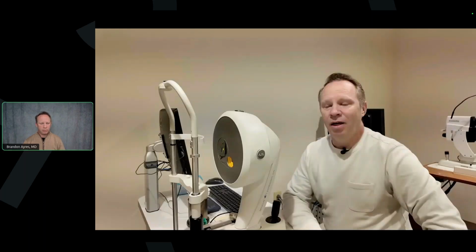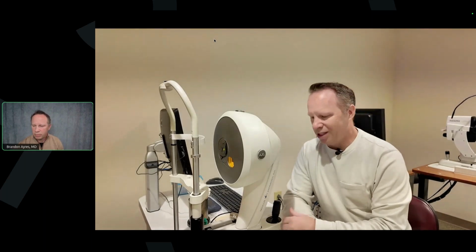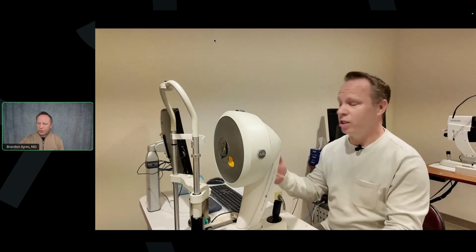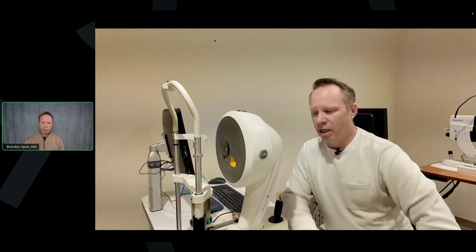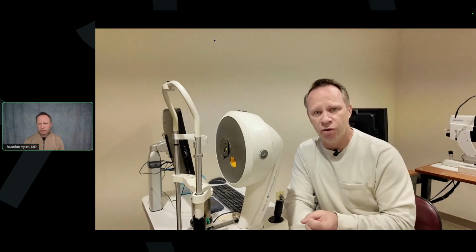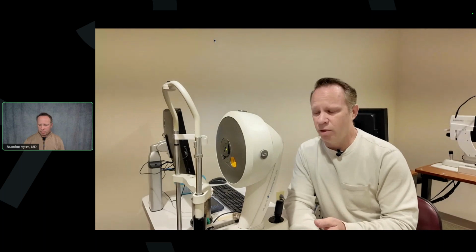Well, here we are in the office, and I figured no better way to discuss the importance of the Pentacam in following our keratoconus patients than to actually bring you in to our Pentacam. I mean, we use our Pentacam to initially screen patients. We use them to monitor, to screen for progression. We use it to see the effect that we get when somebody has had collagen cross-linking.